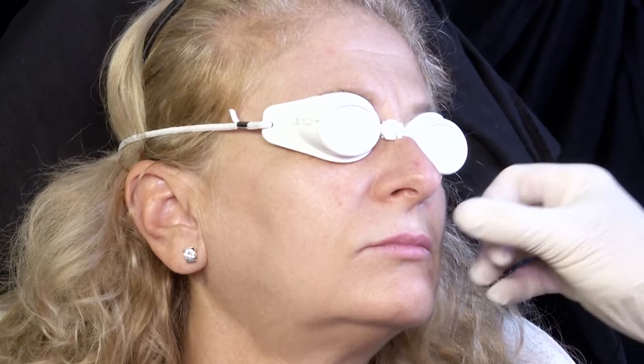All I'm doing is targeting water in her skin — I'm heating up the water. That will lead to new collagen formation and improved skin toning. She'll get a little bit of a lift in her upper lip, and overall her color will be better. Now we're going to treat the telangiectasia on her nose.